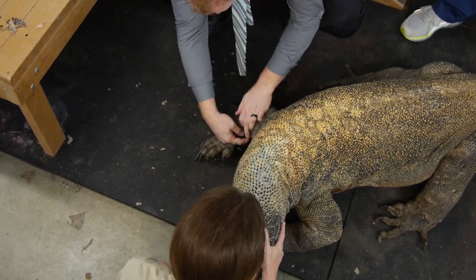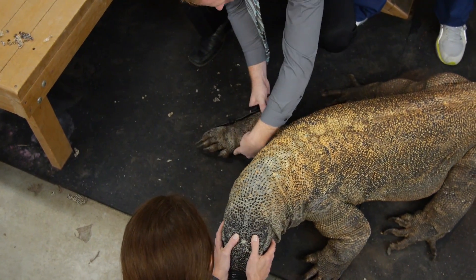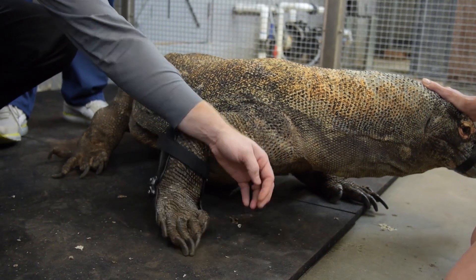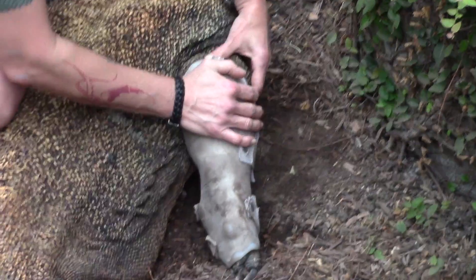The brace is doing exactly what we want it to do — it's making him walk properly. He's wearing it most of the time now. I do give him a little break, so we don't yet have long periods of time where he's walking without the brace. But I think it's already making a difference, because when I give him a break and he walks around, you can see his foot kind of go to the side like it wants to flip over, but then it winds up going the right way. So I think it's already training that foot to come down correctly.